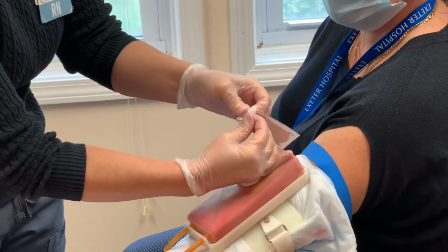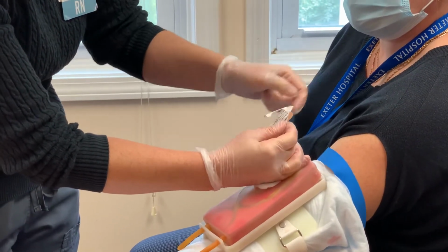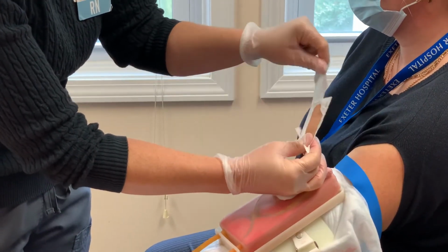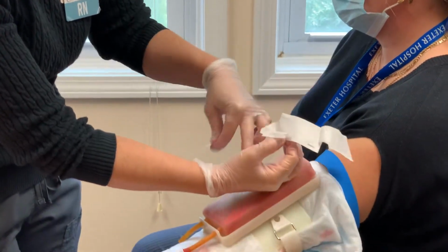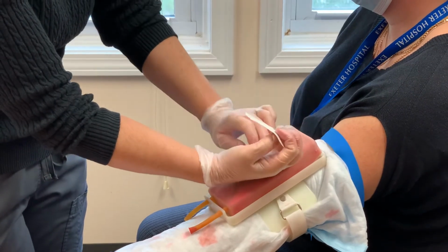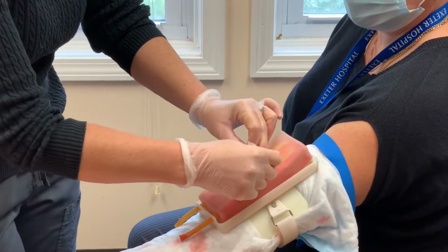The other thing you're going to do before you leave the home is label your specimens in front of the patient. You're going to be labeling 5 things: the patient's name, date of birth, the date, the time, and your initials. And you're going to be doing that at the patient's home.